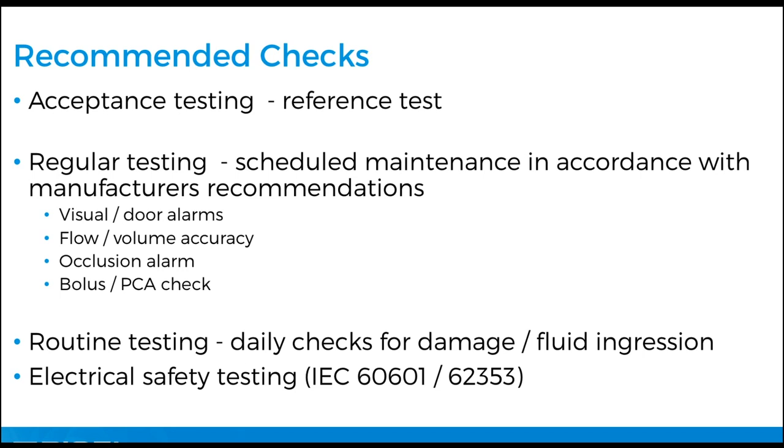Regular testing, so this is the scheduled maintenance in accordance with the manufacturer's recommendations. This could be risk-based, or it could be typically annually, where you would look at visuals and door alarms to make sure that everything mechanically is sound in regards to alarm settings. Then we look at flow and volume accuracy that's specified by the manufacturer. We check the occlusion alarms to make sure they are functioning correctly.